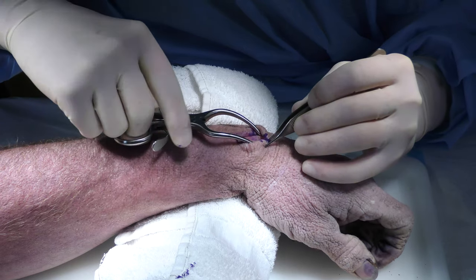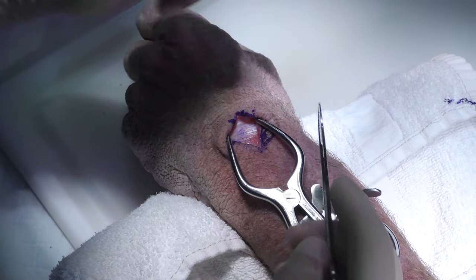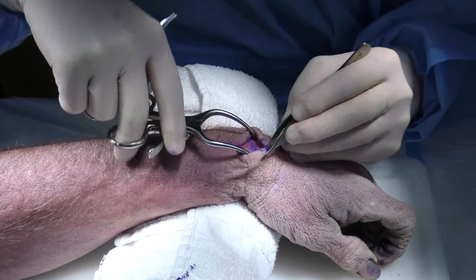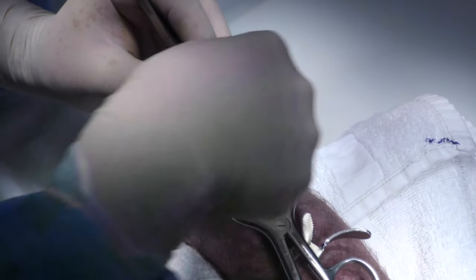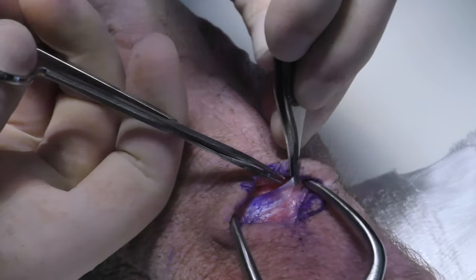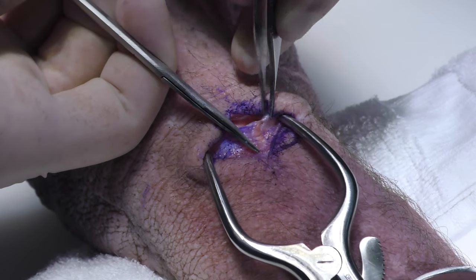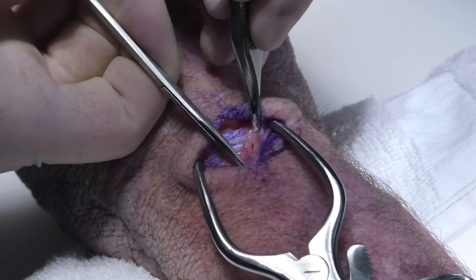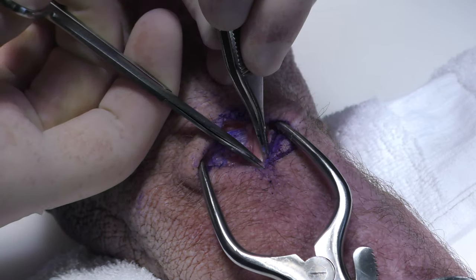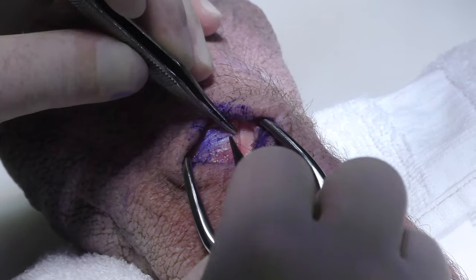And so we're right down on the retinaculum. Here is the extensor retinaculum. You should still be able to palpate Lister's tubercle, which is right here. The EPL tendon is right here, and I'm going to release that so that we can get it out of the way and protect it a little bit. Of course, try not to cut it while you're releasing it. So that's a good landmark.